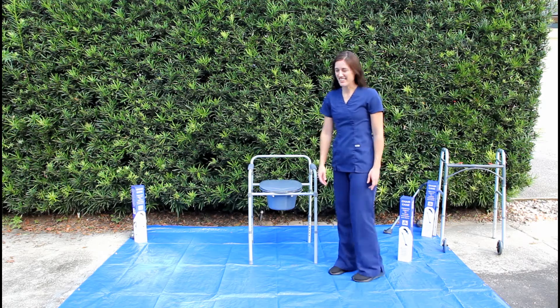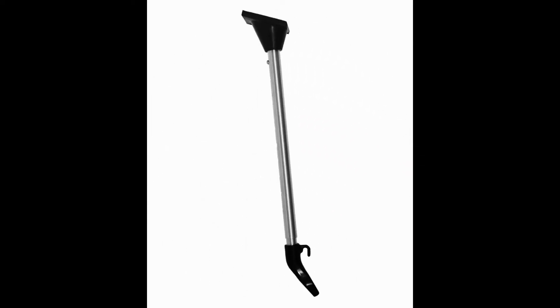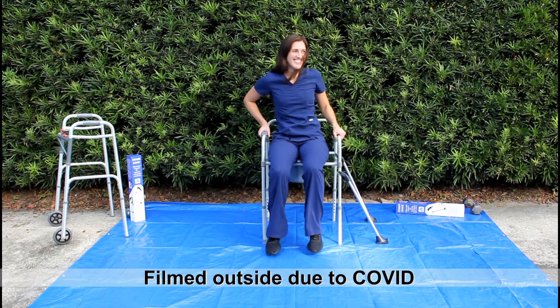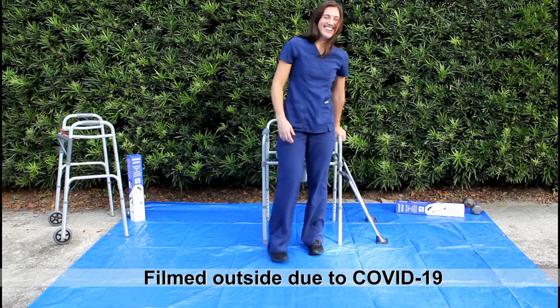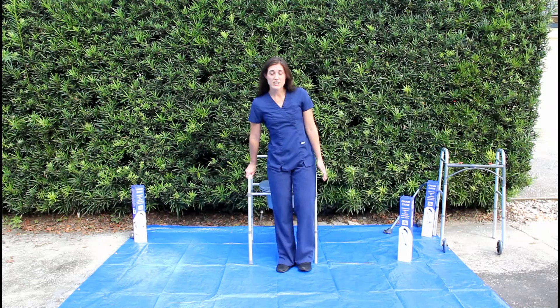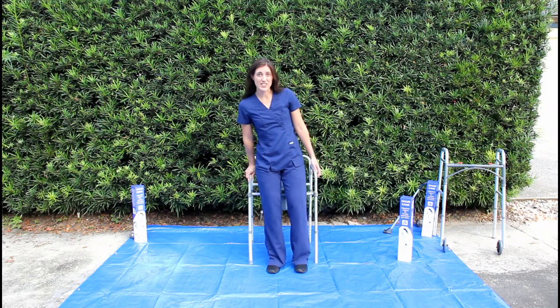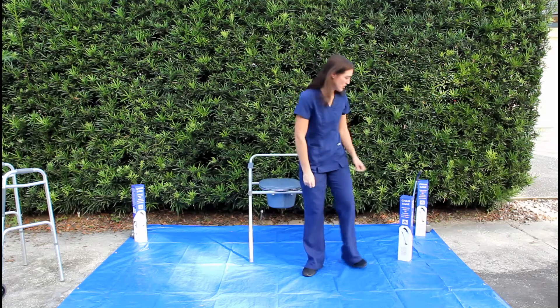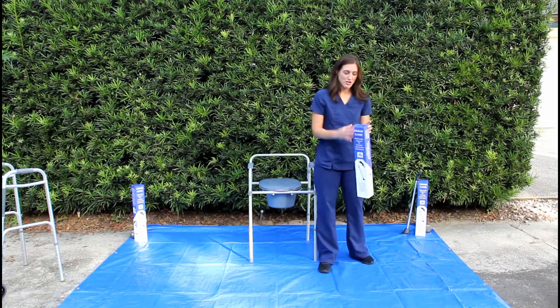Welcome to the demonstration of the Chair Cane. Sometimes when you get a 3-in-1 commode, it's wobbly when you try to sit down. If you have trouble sitting down without wobbling the commode, here's the Chair Cane, and I'll show you how to use it.